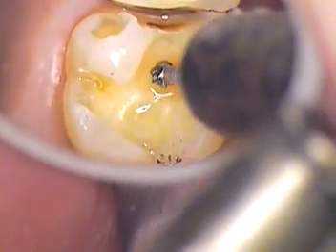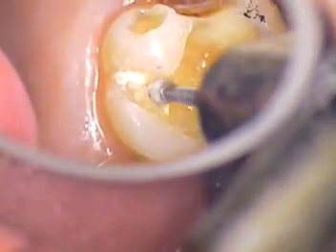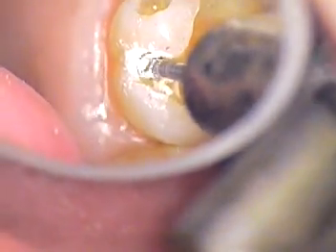Just gently dry the tooth now — just gently air on it. Now you're going to feel just a little more. I'm going to push a little bit, and we just get a little more to clean out that lingual.